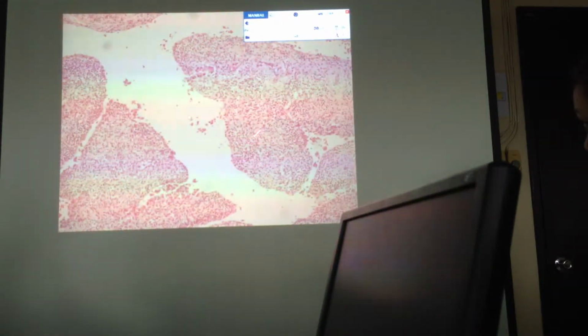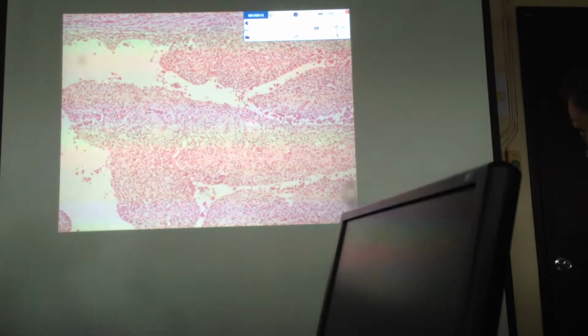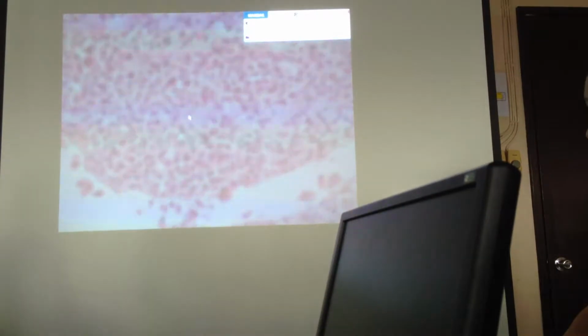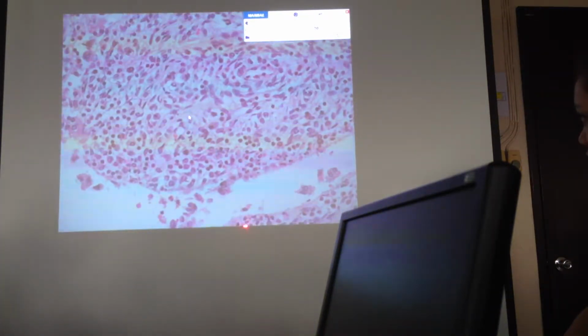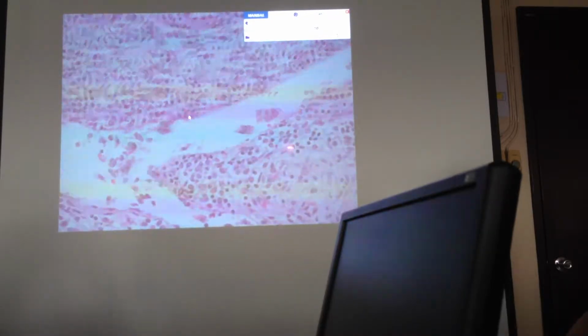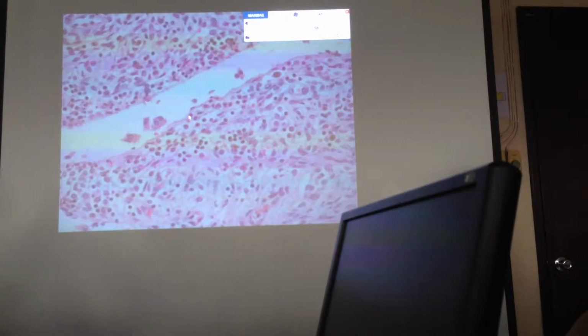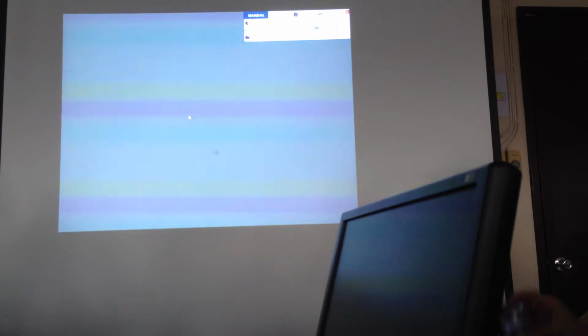When you have mixed infiltrates, nakita nyo naman yung slide na to. It's labeled as acute salpingitis, kaya lang there's already the presence of mononuclear cells, okay, accompanying the neutrophils. Okay, so ito may mga neutrophils kayo, but you also have histiocytes and lymphocytes. Okay. Next.